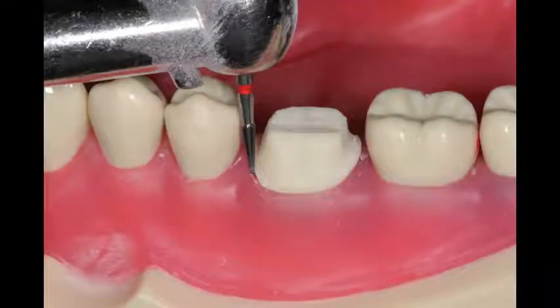When we're done refining the prep, I'll take the carbide finishing burr, go down inside the sulcus, go 360 degrees around. It causes a little bit of bleeding, but that can be controlled. I create a larger sulcular crevice upon which I'll put some kind of retraction paste followed by a copper cap. The benefit of this is we get a very nice, predictable, and quick retraction of the gum tissues so that we can move on to our impression technique.